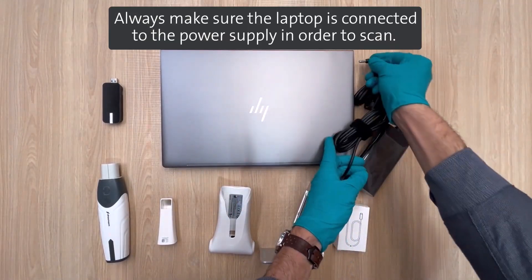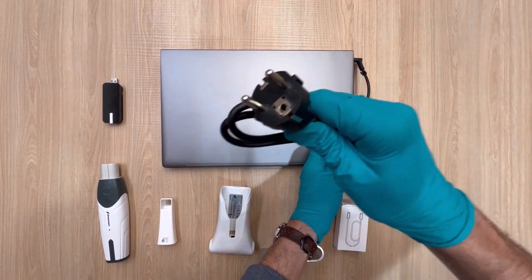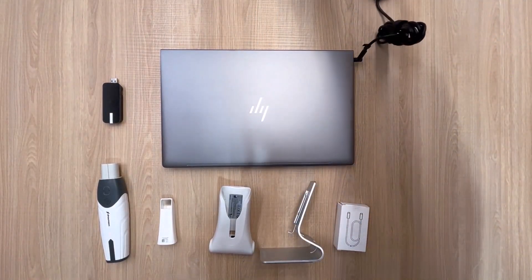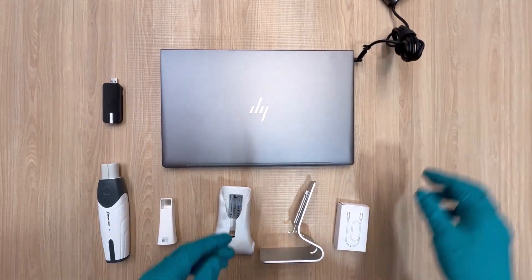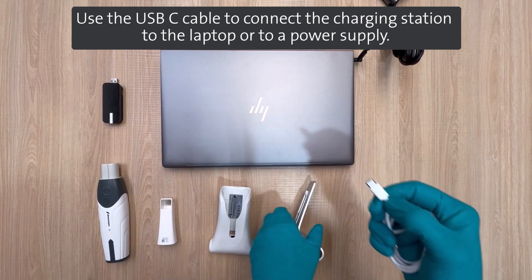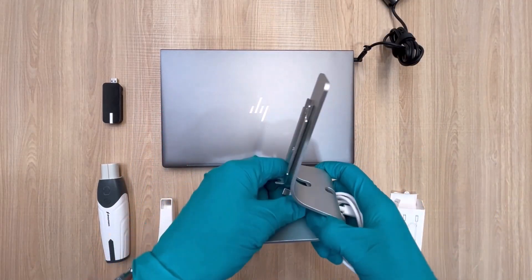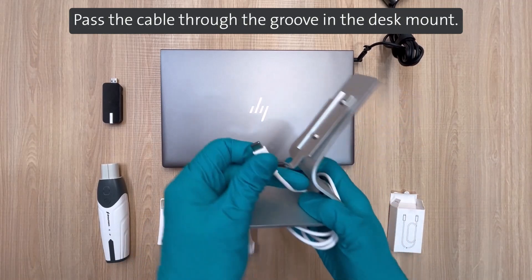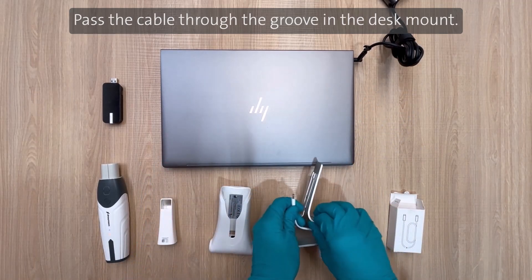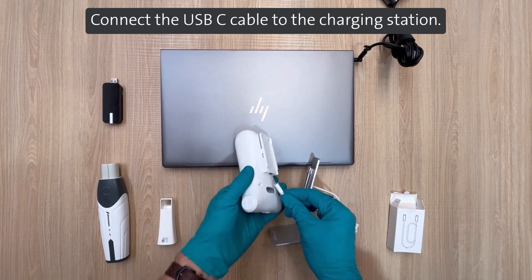Always make sure the laptop is connected to the power supply in order to scan. Use the USB-C cable to connect the charging station to the laptop or to a power supply. Pass the cable through the groove in the desk mount, then connect the USB-C cable to the charging station.